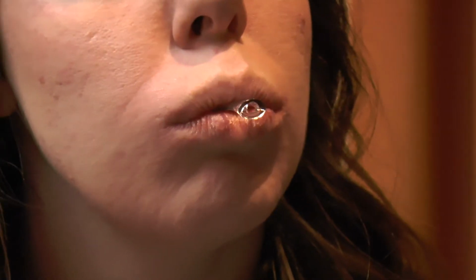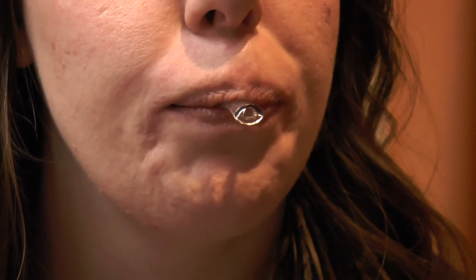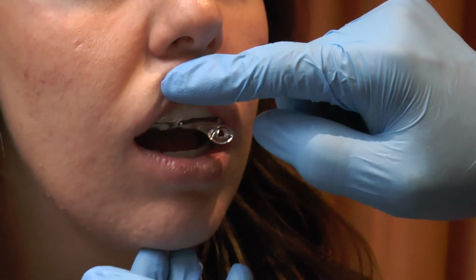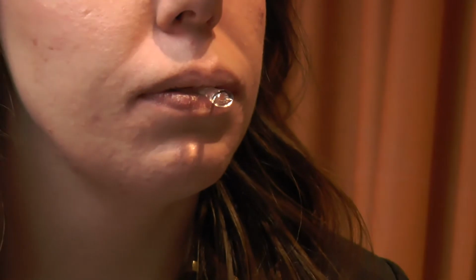The next set of instructions will be for her to pucker up her cheeks nice and tight, and we would do this for probably 10 or 15 seconds, and then also take the tongue and thrust it up against the roof of her mouth to have it mold on the underside of the upper arch. Okay, and we'll just let it set up. In about a minute, I'll go back in and run my fingers on the buccal aspect just to get it to adapt to the teeth a little bit better. So as this is setting up, you can go ahead and get ready by getting the lower tray prepped, where you'll immerse it in warm water.